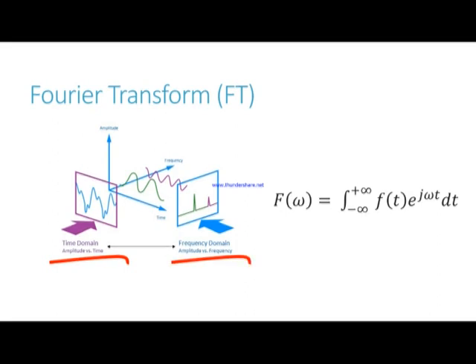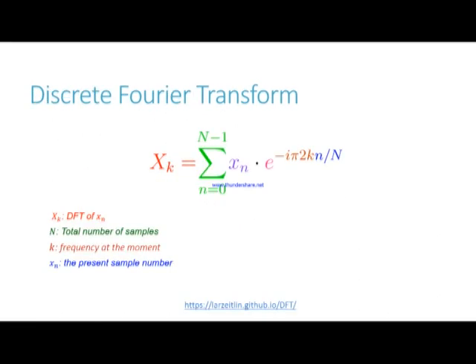And we're going to use the computer to take some samples. So the Fourier Transform is going to be converted into the discrete Fourier Transform now. The discrete Fourier Transform, or DFT, is the equivalent of the continuous Fourier Transform for signals known only at a specific instance.